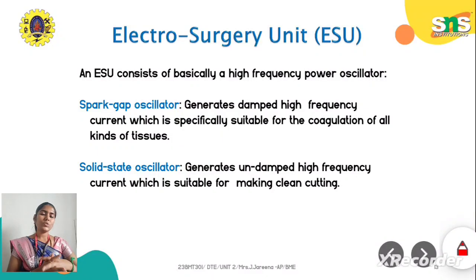Everyone, in today's class we are going to continue the last class topic, that is the ESU unit. In this class we will discuss the important building block of the ESU unit, that is the power oscillator, because we already know the ESU unit is meant for generating high frequency current. The power oscillator is the heart of the ESU, which is meant for generating high frequency current.